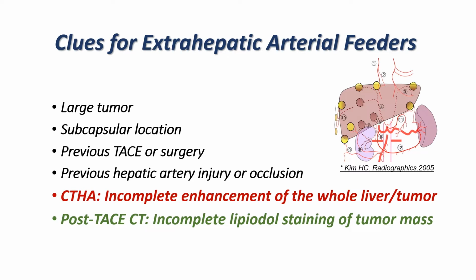Another clue is when you find incomplete lipiodol staining within a tumor mass after embolization. That area might be supplied by a non-embolized extrahepatic branch.